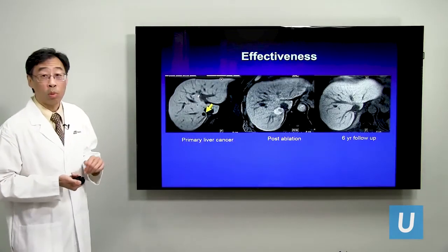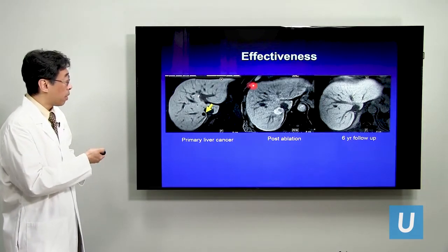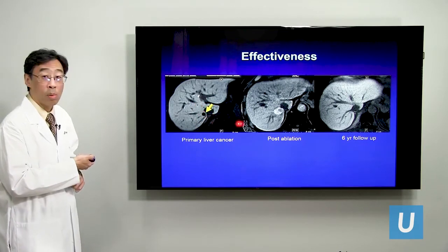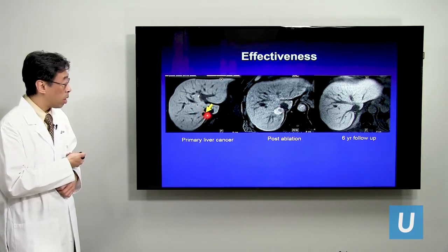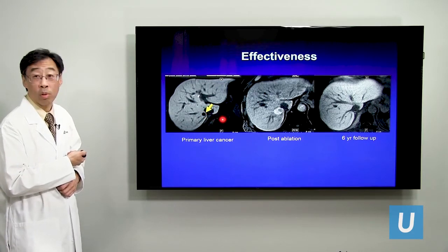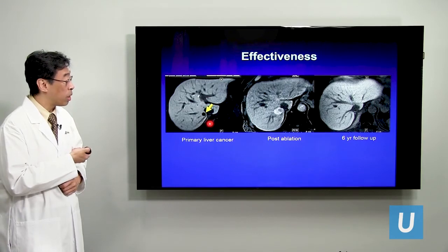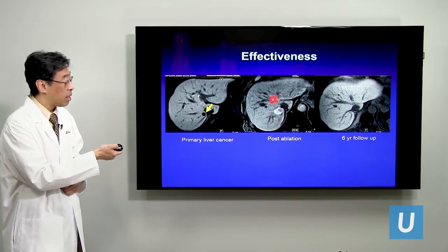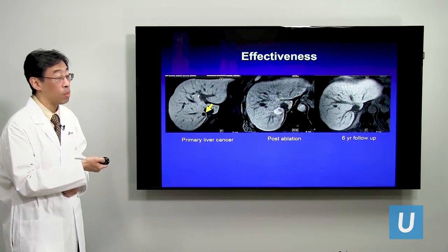And there's another example of what we like to achieve. This is, again, liver cancer that has developed and was caught early on, so it's a small tumor. Very deep inside the liver, so this would have required a major surgery to get to. But if we can get a simple needle into this thing, we can burn it with the result looking like this. Again, that white burnt zone completely covering the tumor itself.